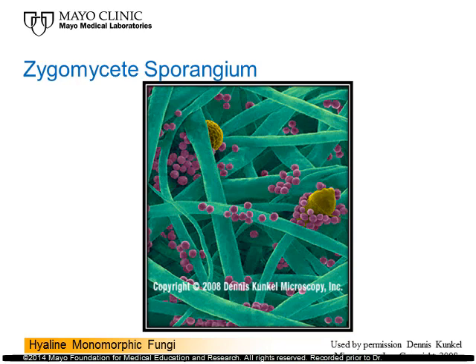Another photograph shows the hyphae — most are very large, though occasionally you see a smaller hyphal strand. The golden-colored structure inside is a sporangium that has been popped open, with spores sitting around on the outside. The structure sticking up inside that big sporangium sac is called the columella — you see those when you make mounts, in certain of the organisms.